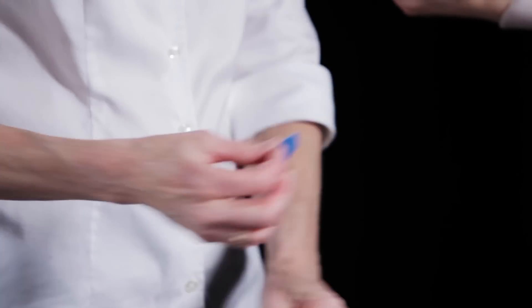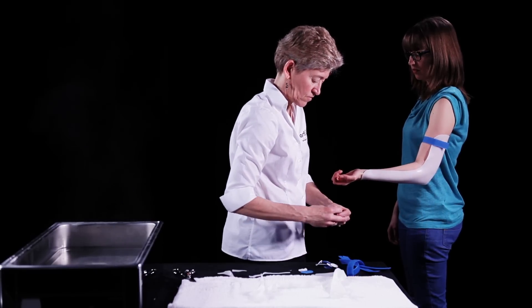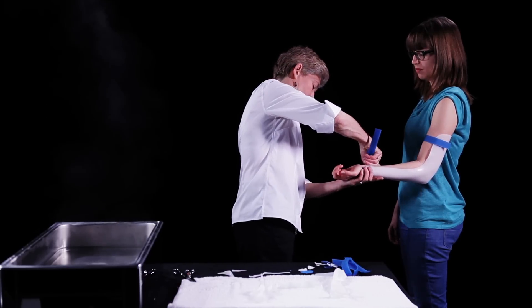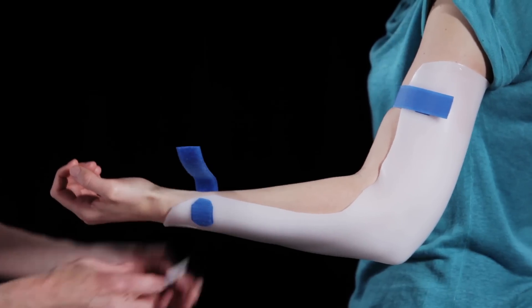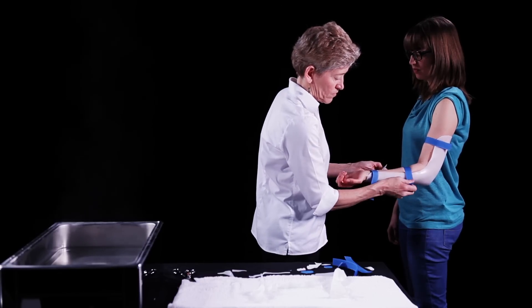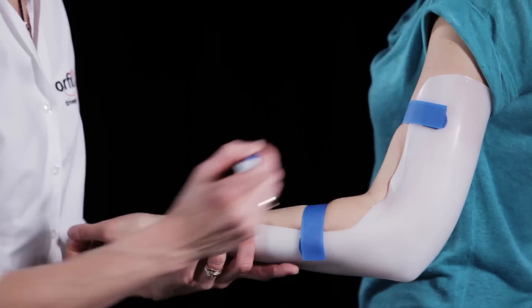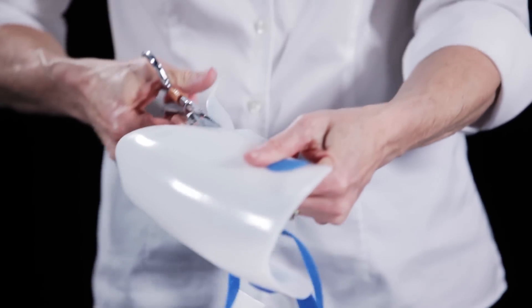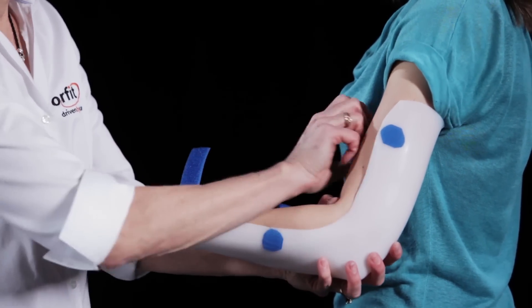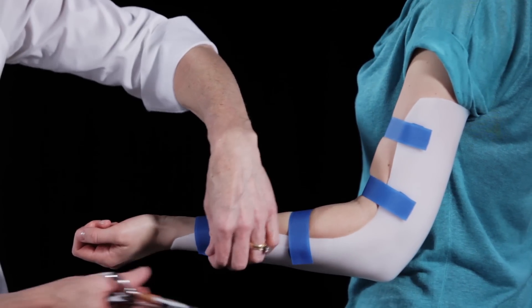Prepare velcro loop straps and velcro adhesive backed hook. Place one velcro loop strap at the proximal border and one at the distal border. A third strap is placed on the forearm. Check the fit one more time and mark any additional areas that need trimming. Add one additional strap to the upper arm.